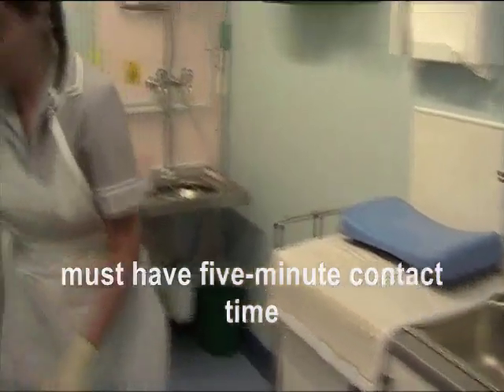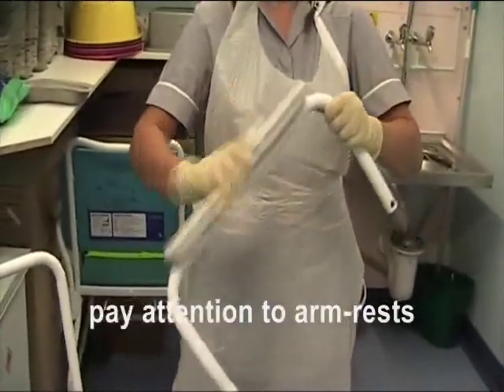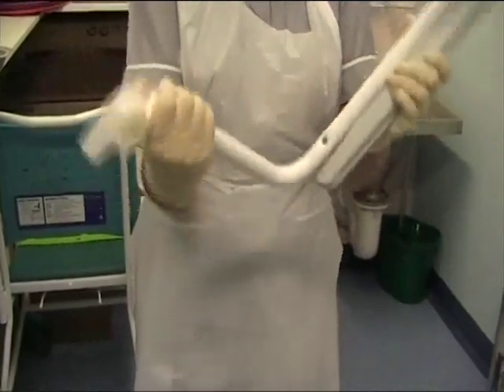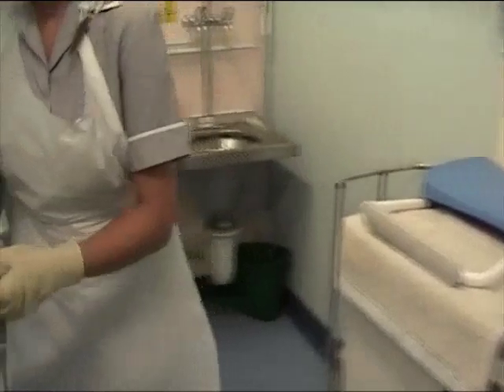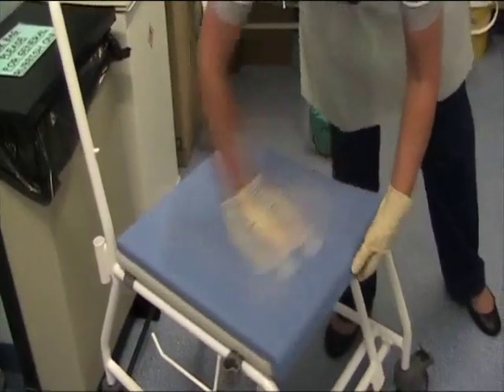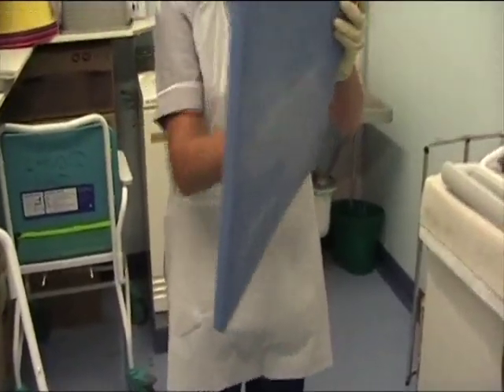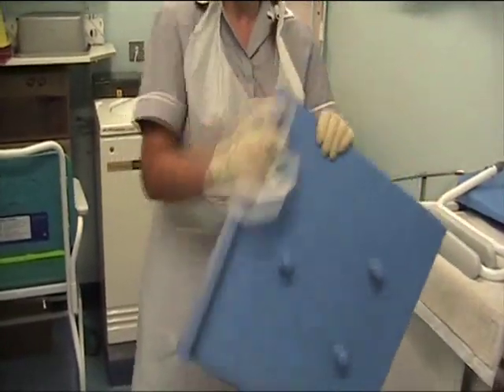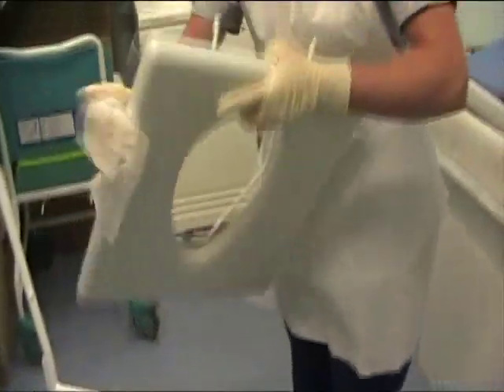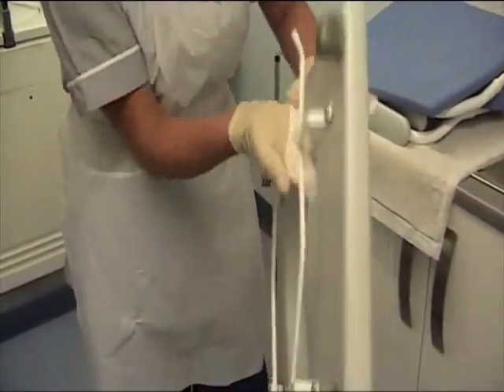This allows a five-minute contact time for the full disinfection to take place. Ensure you pay particular attention to the parts that patients will have contact with and that can become very easily contaminated. Ensure the underside of the seat and the bracket are thoroughly cleaned as they very easily become soiled.